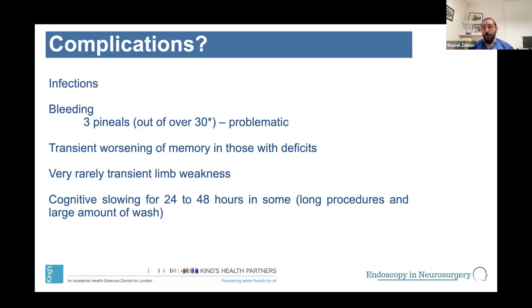When you go in microscopically, you almost feel like you're in a position where you have to take a tumor out. Often it's been things like ependymomas, medulloblastomas, and so on, where you do have to get a good clearance, or some of the pineal tumors. That's where we've run into trouble. But specific to endoscopy, infection, yes, although interestingly, when we've done really big, long procedures, we haven't had problems with infections as much as one would think.